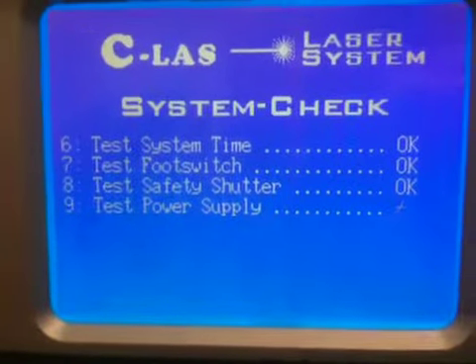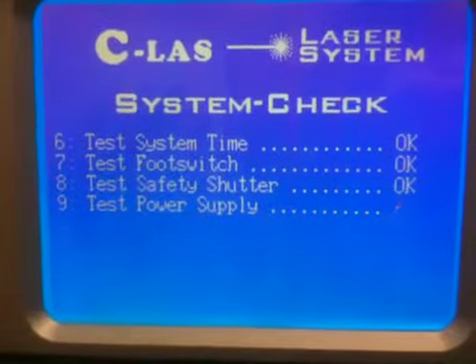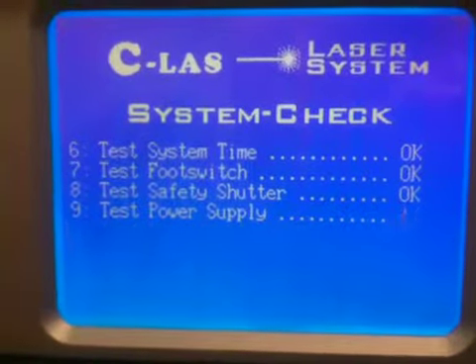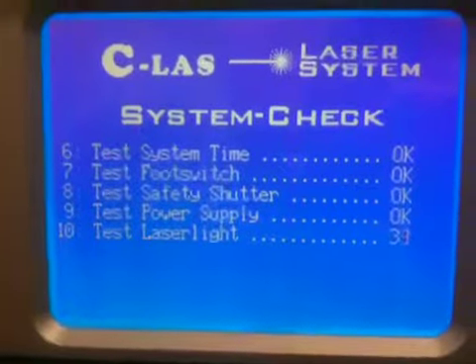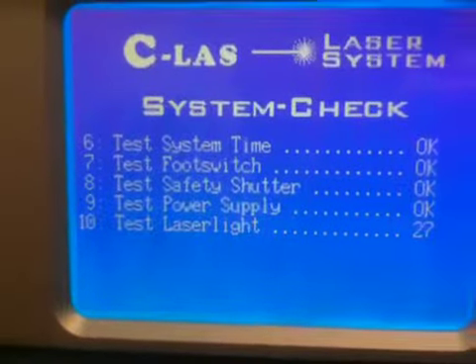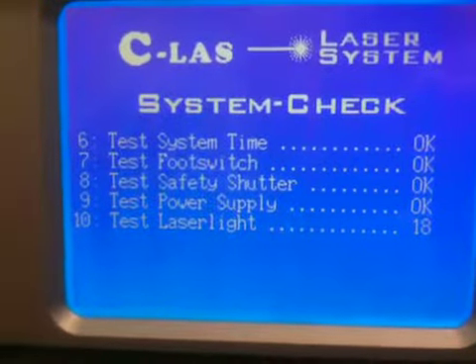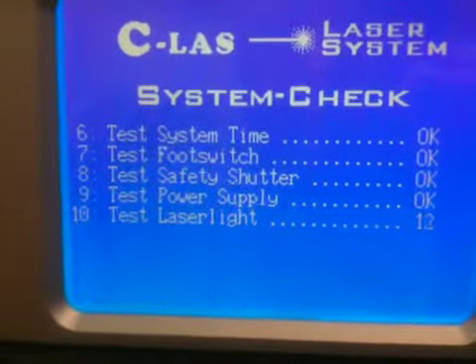Okay, so what we see as being convenient is either it always starts at the same setting, some kind of CW setting, or we can do what's done on version 1.6, which starts the laser at whatever you had it before, but at 4 watts. So if you finished using the system on day one at, let's say, 14 watts and 100 millisecond single pass, when you restart the laser the next time, it's going to be at 4 watts, 100 milliseconds. So it's very consistent, and it works out very well.